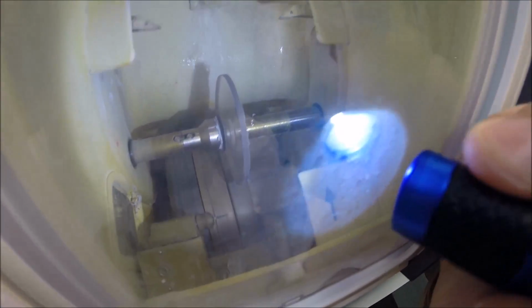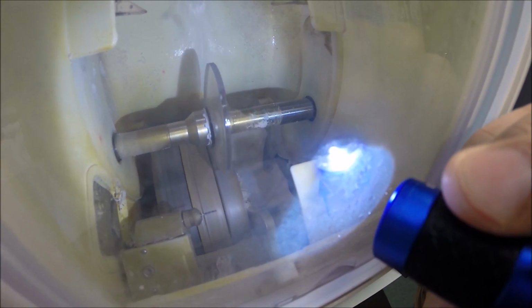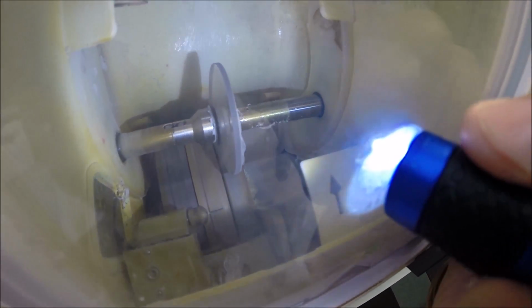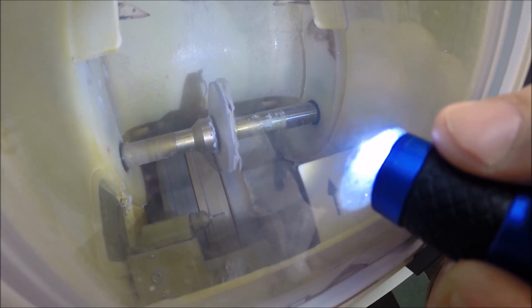So polycarbonate lenses do cut dry, while plastic, high index plastic, and Trivex cut wet. Now water will spray onto the lens for the last 20 seconds to wash away the optical debris that you see beginning to form on the lens. You see it. Ooh, there's a good piece. I want to reach in there and get that. Look at that. That is awesome.